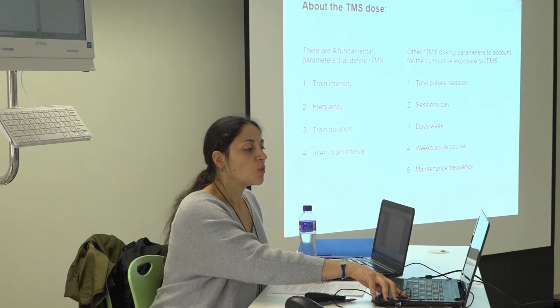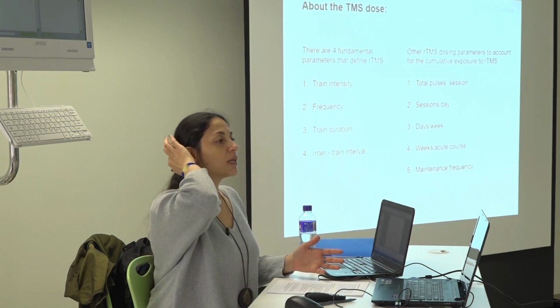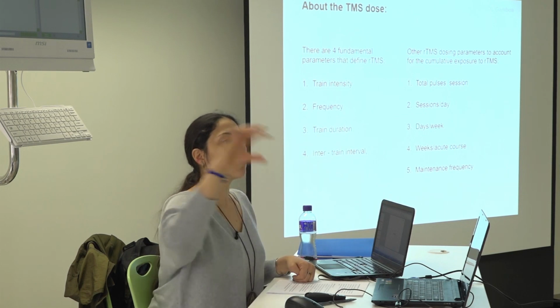How many days per week do you want? How many weeks do you want to do this? For example, for depression treatment studies, it could be 1 month, 4 weeks, 5 days per week, and I think it's 1 session per day. So you want to consider that. And what about the frequency?